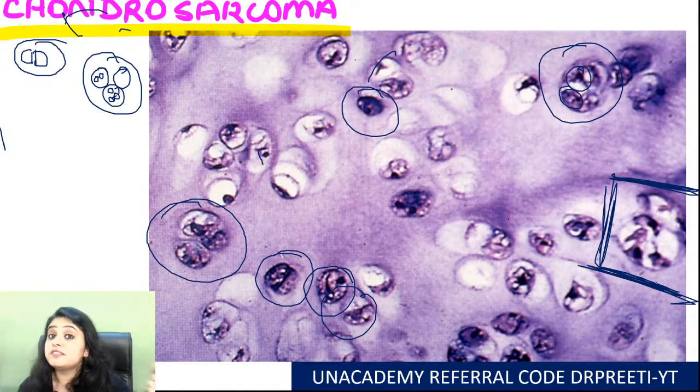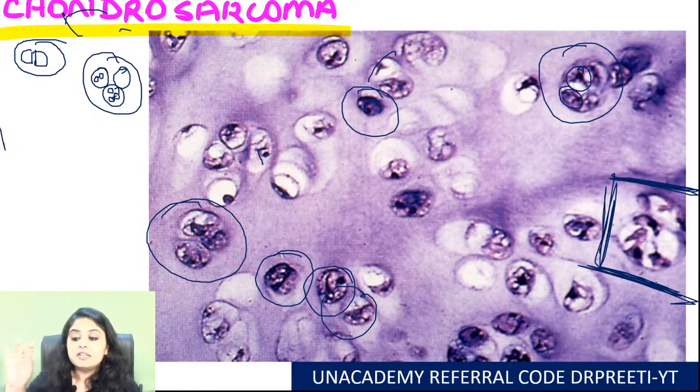Is this clear? So that is why in enchondroma, remember in that finger tumor, the phalanx tumor, I was again and again emphasizing permeation is not seen, because if it is seen, that is what makes it chondrosarcoma. Permeation is the hint out here.